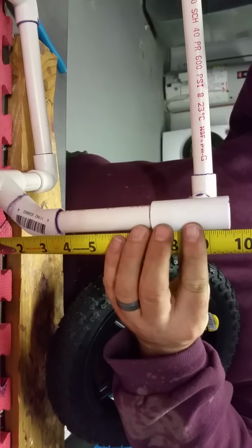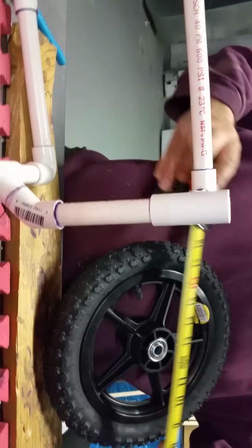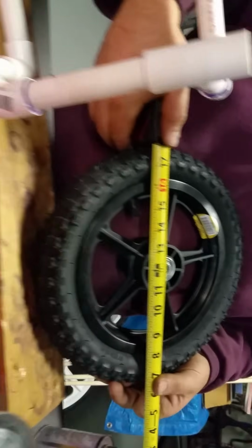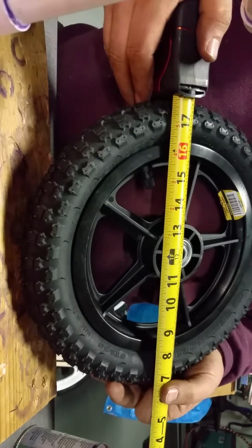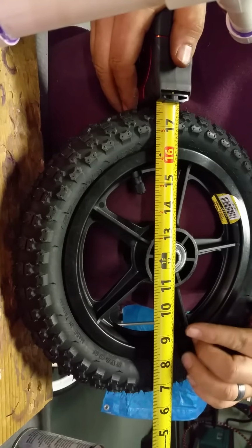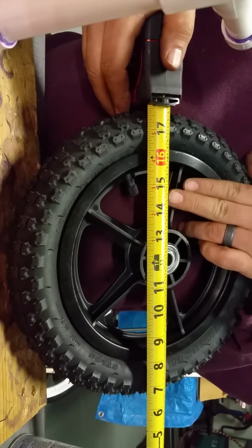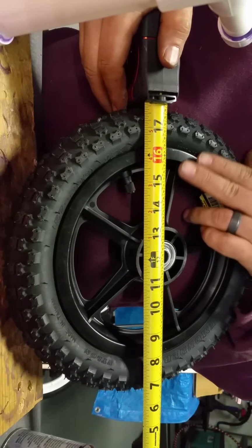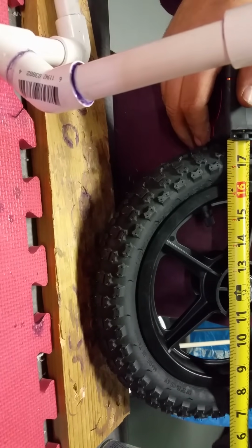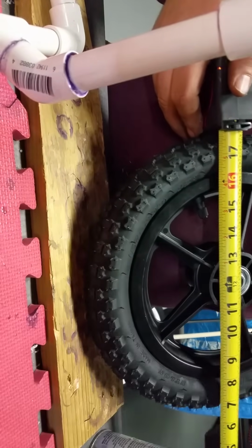So as a review, now we have 9 inches of usable height already built into our cart. With the measuring tape set at 18 inches, our overall goal height. Our hub is at 12 inches. Our axle is at 12 inches. And now we need to take into consideration that we want some room for adjustment. So we need to think, how far can we adjust or leave room for adjustment without that PVC pipe dragging on the ground? So I'm going to go 14 inches minus the 9 inches of usable pipe. So that makes my pipe 5 inches that I need to cut. But go ahead.